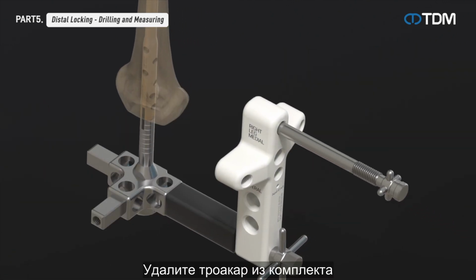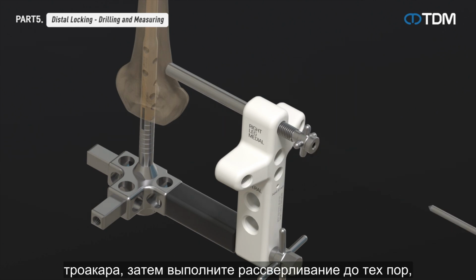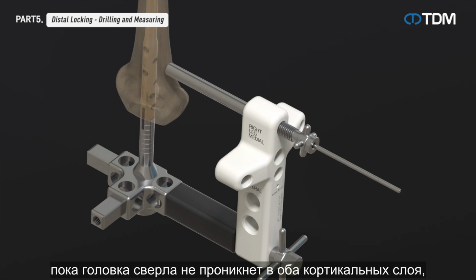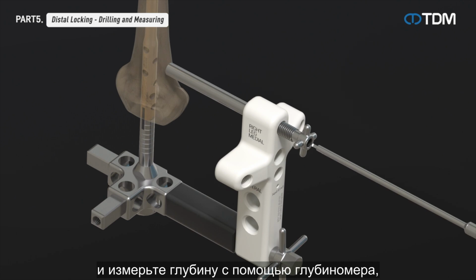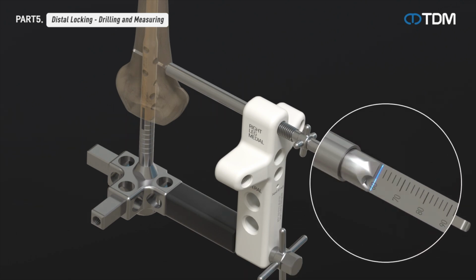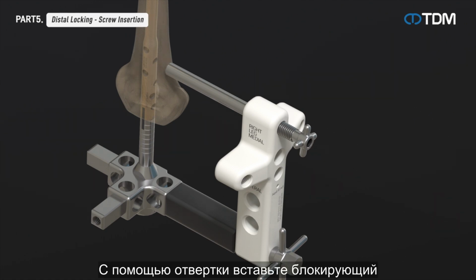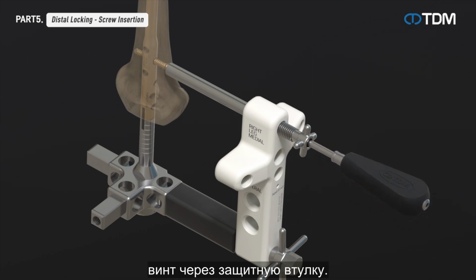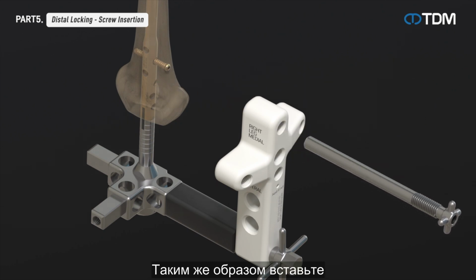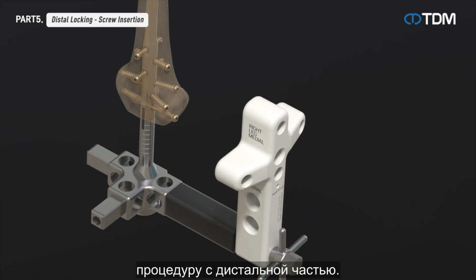Remove the trocar from the combination of protection sleeve, drill sleeve, and trocar. Then drill until the drill bit penetrates both cortex. And measure the depth with the depth gauge to determine the length of the screw. Using a screwdriver, insert the locking screw through the protection sleeve. Insert the remaining locking screws in the same way to complete the distal part procedure.